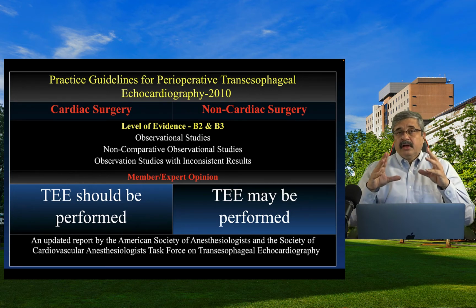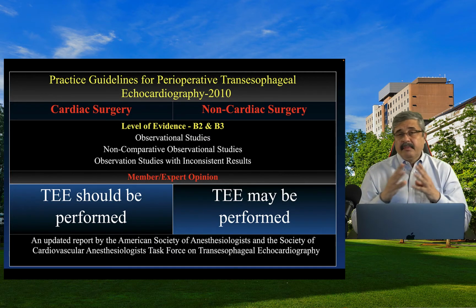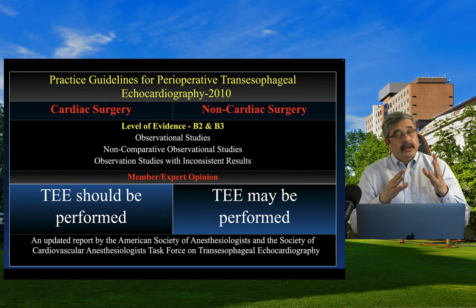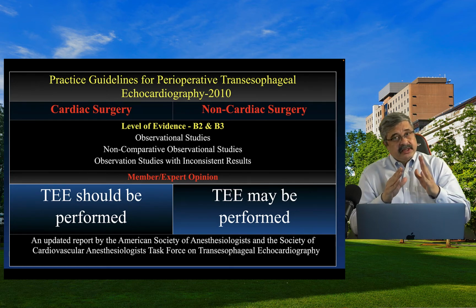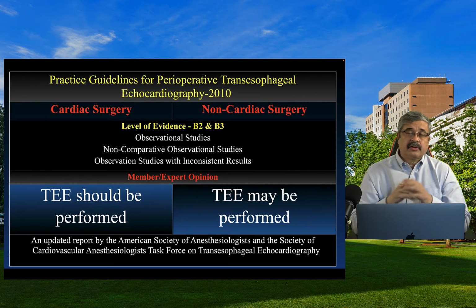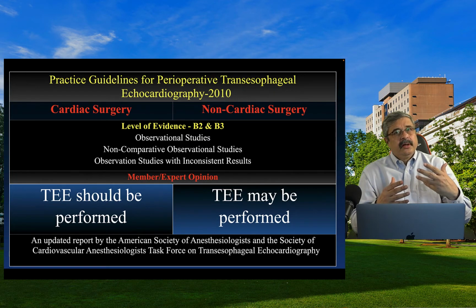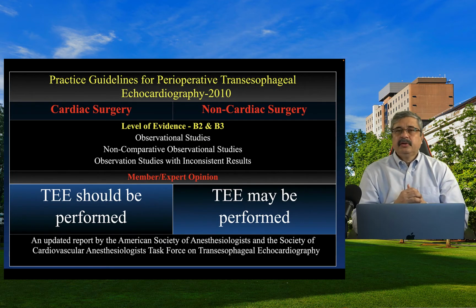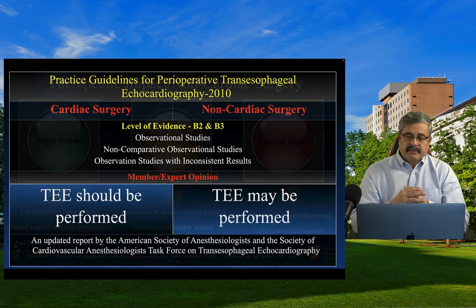However, based on evaluation of this evidence for both cardiac as well as non-cardiac surgery, the members of the expert opinion for cardiac surgery felt that transesophageal echocardiography should be performed as a routine monitor. However, based on the same evidence, they said transesophageal echo may be performed in high-risk non-cardiac surgery. So there's a little bit of paradox, possibly because there are more people trained in the cardiac arena in using transesophageal echo as opposed to the non-cardiac surgery arena.